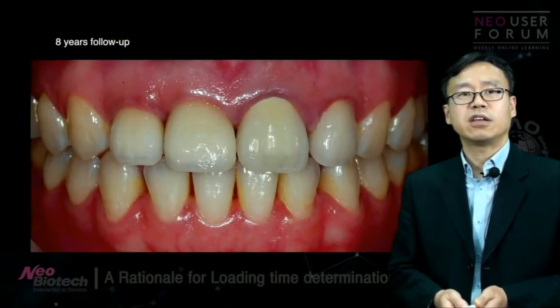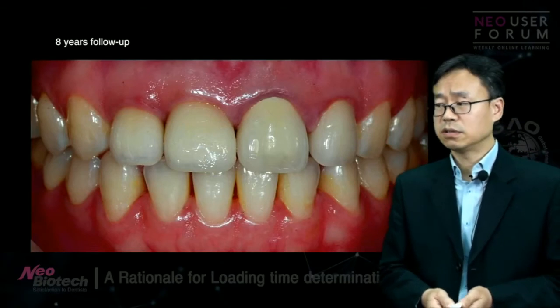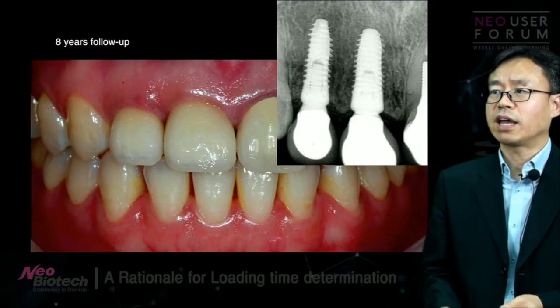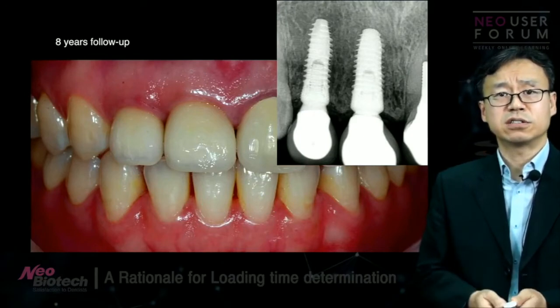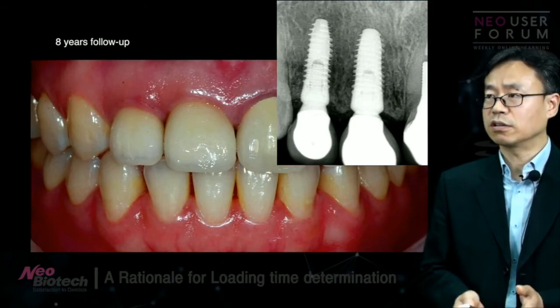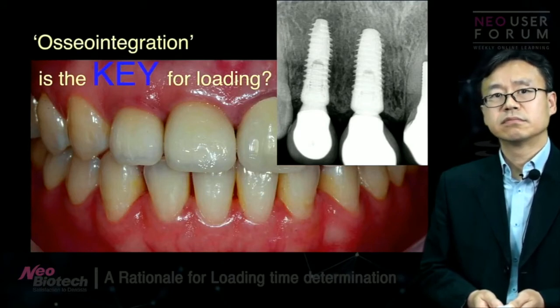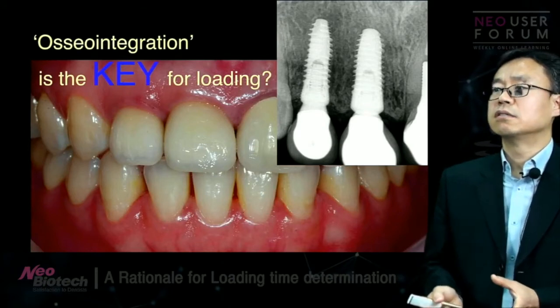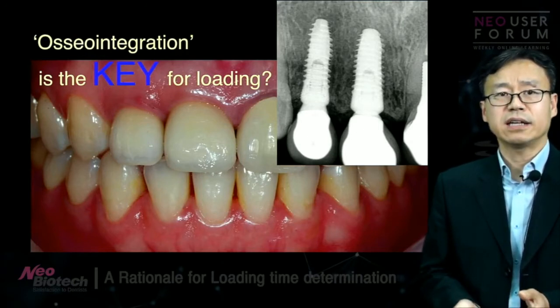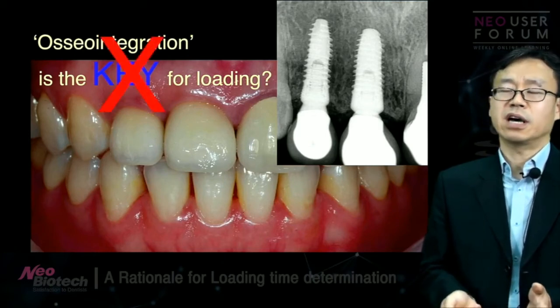And this is the 8 years follow-up. I took this picture last year. And the X-ray shows you the great preservation of the interdental bone. And the whole bone level is pretty good after about 9 years. So, did I have osseointegration in this particular case before loading? Probably not.